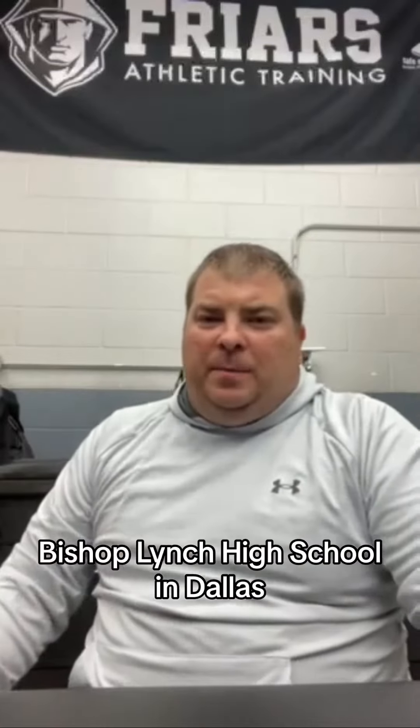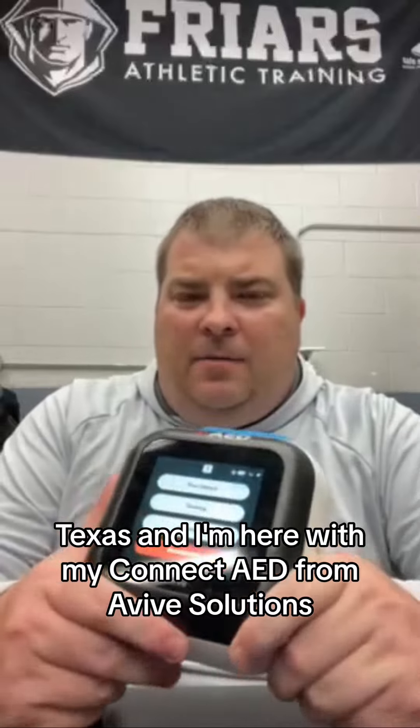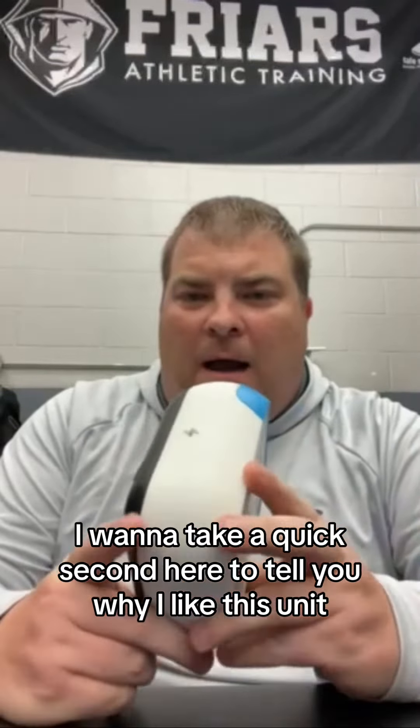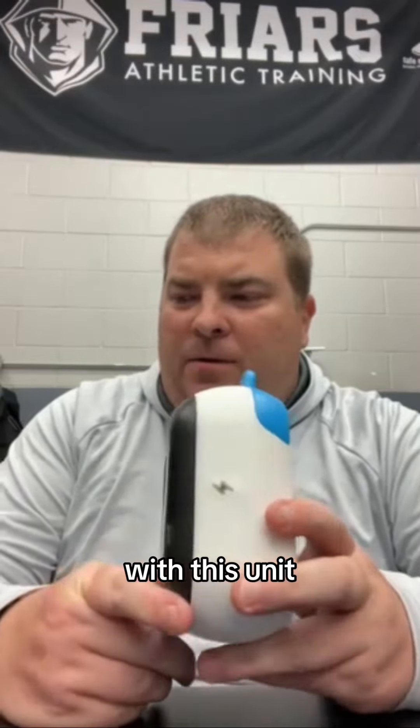Mike Hopper here, Head Athletic Trainer at Bishop Lynch High School in Dallas, Texas, and I'm here with my Connect AED from Avive Solutions. I want to take a quick second to tell you why I like this unit and one of the cool features that I find with this unit.